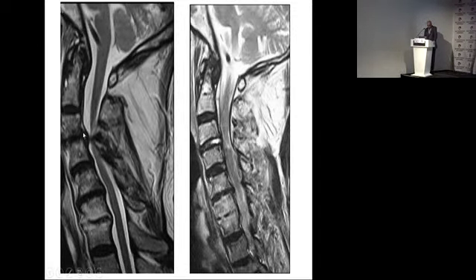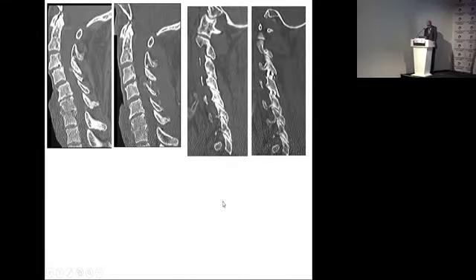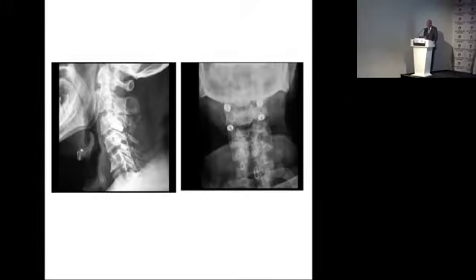You see there is an osteophyte formation, and this is the postoperative, a new disc formation. You see the ligamentous buckling, and you see the ligamentous stretch, and you see the cervical realignment. This is the scan, and you see here, this is intra-articular spacers. You see this is postoperative, the increase in the disc space height, increase in the canalicular height, increase in the facetal height. More importantly, improvement in the clinical condition of the patient.